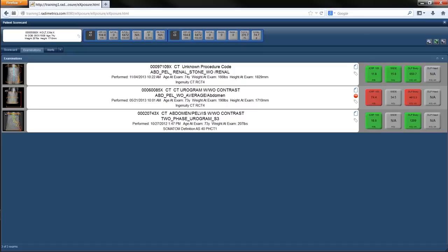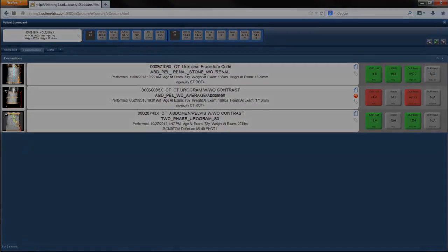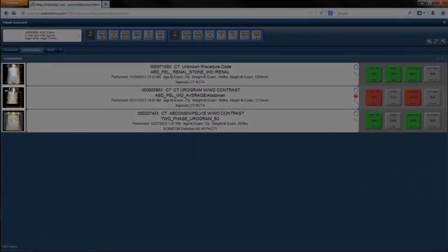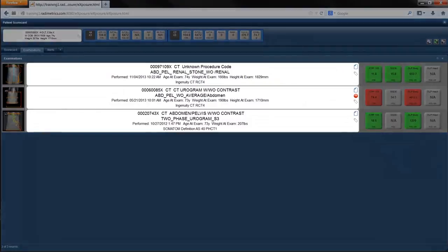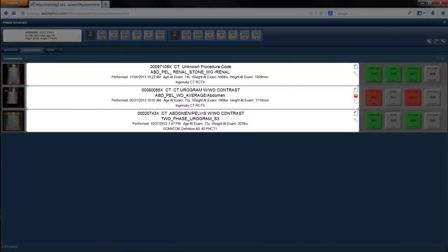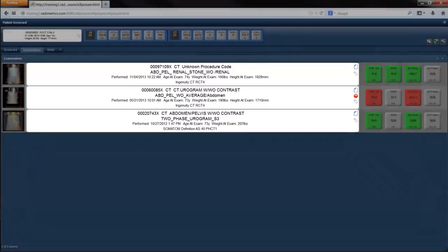On the left, you see a localizer image from the study, an examination label with the order of study description, protocol name, information about the exam, patient parameters, and information about the piece of equipment upon which the examination was performed.